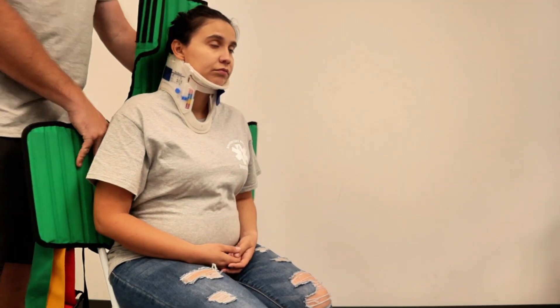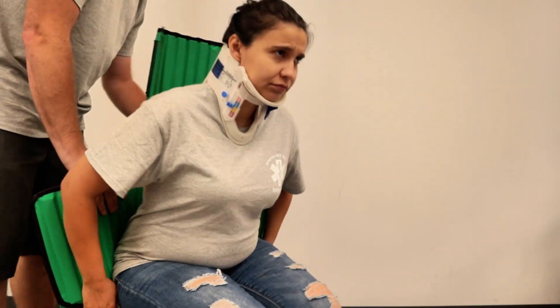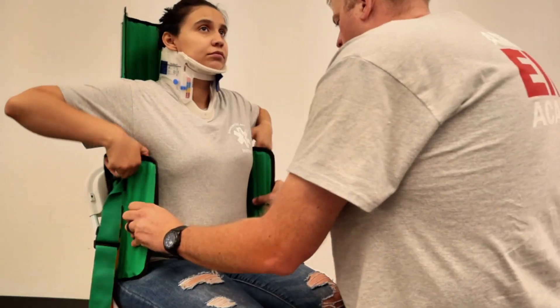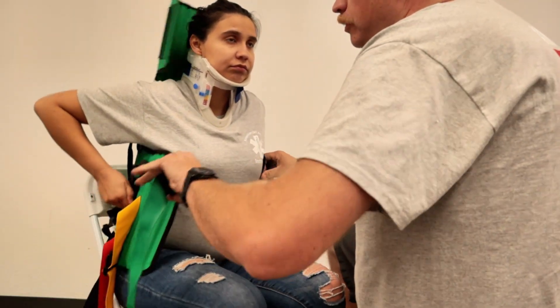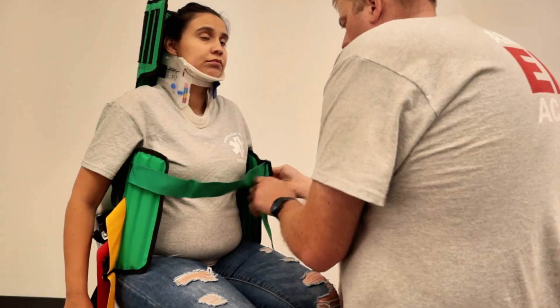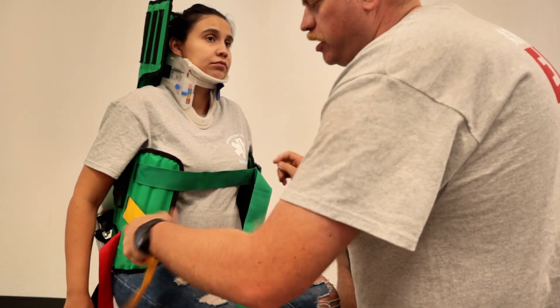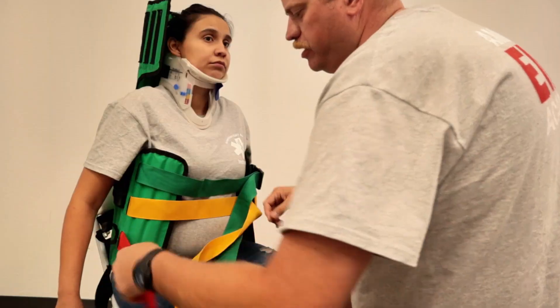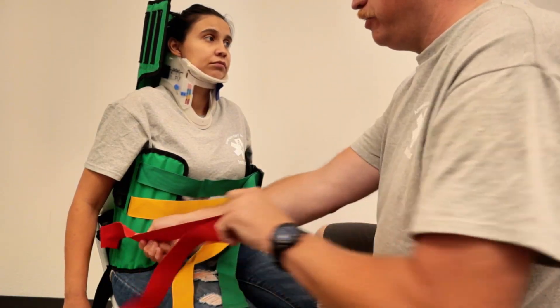I'm going to have her sit forward, and with somebody holding her, try and work this device in and have them spread their arms out. Make sure it's down behind them. You want to make sure all your straps are pretty free and clear and easy. We're going to start working on bringing everything together. Go ahead and lift your arms for me. We want to make sure we bring all our straps out and have enough slack, and just like a regular one, start tightening. We'll wait to cinch down, but you want a little bit of tension in there just to help as you progress further down.